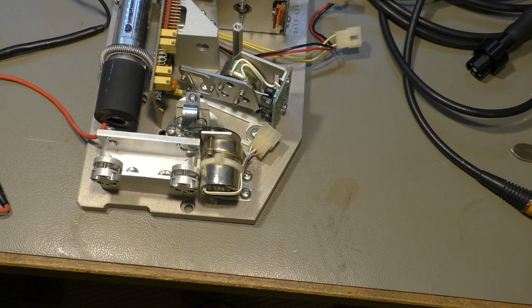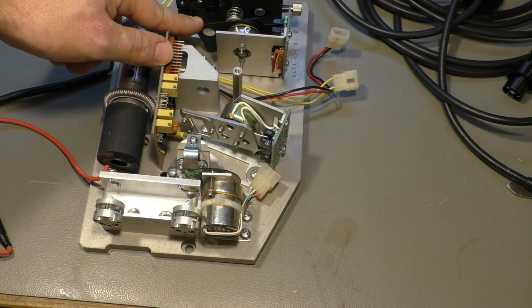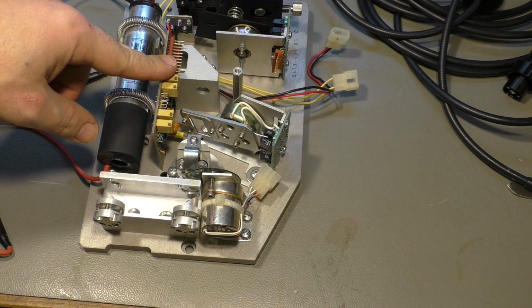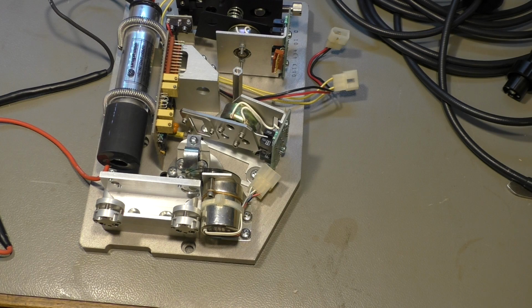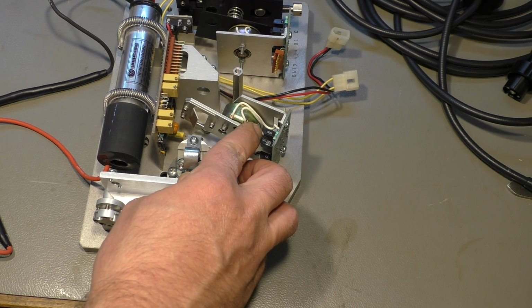These argon lasers you can have with only one single line of greenish blue, or you can have it with multiple laser lines or laser wavelengths in one shot, and you just filter that blue part out and you get a green laser beam. The power of the green-blue laser is 2.5 watt, and the power of the green-only laser is 1 watt according to the data sheet of this machine. So we are filtering part of the laser spectrum out here to get the pure green laser.